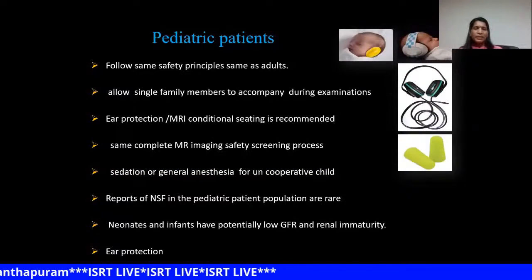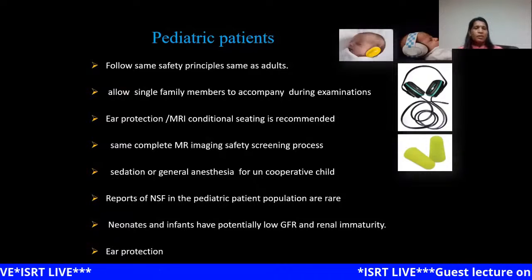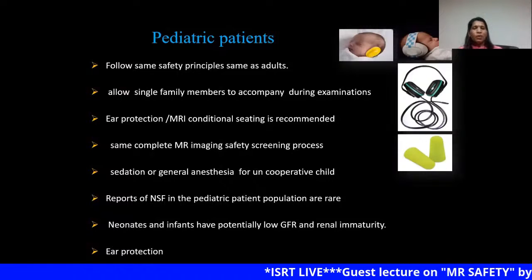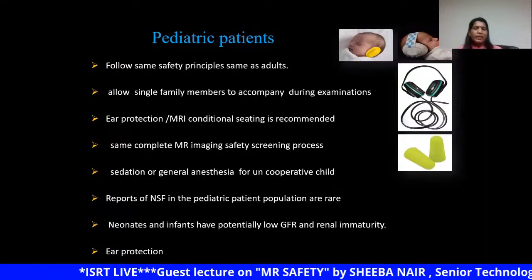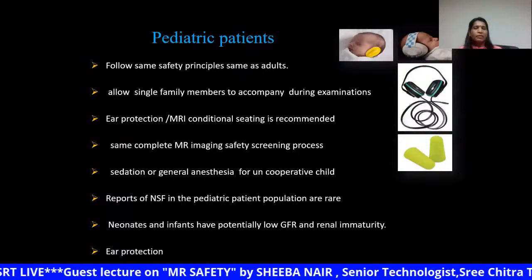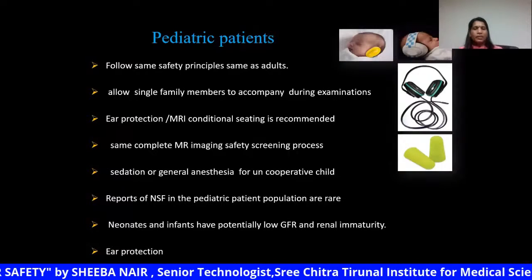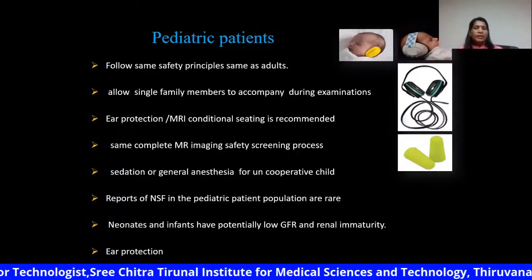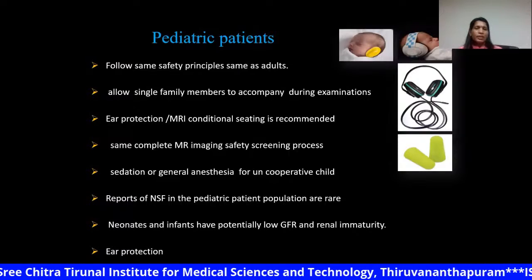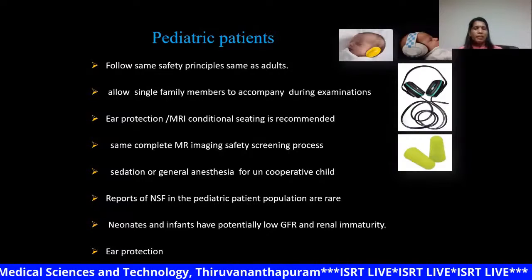Pediatric patients are another concern for MRI. We have to follow all safety principles for pediatric patients in the same way adults are screened. For a child who is able to lie down without anesthesia, we can allow a single family member to accompany them to the MR room.